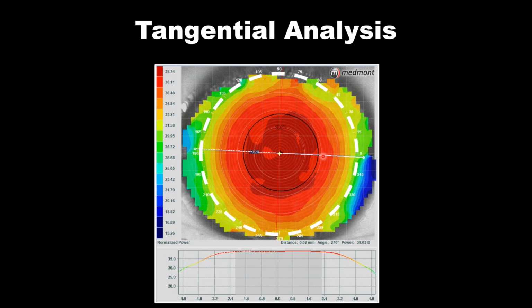With your tangential analysis, we're trying to learn if there's any form of corneal displacement in a regular, normal eye. In this case, if we're fitting an ortho-K lens from the EyeSpace software, we want to know if there's any natural corneal displacement. So looking at these contours in the periphery where the lens will land, do we see any contours that appear pulled in one direction or the other, or does this eye favor a more droopy inferior displacement?